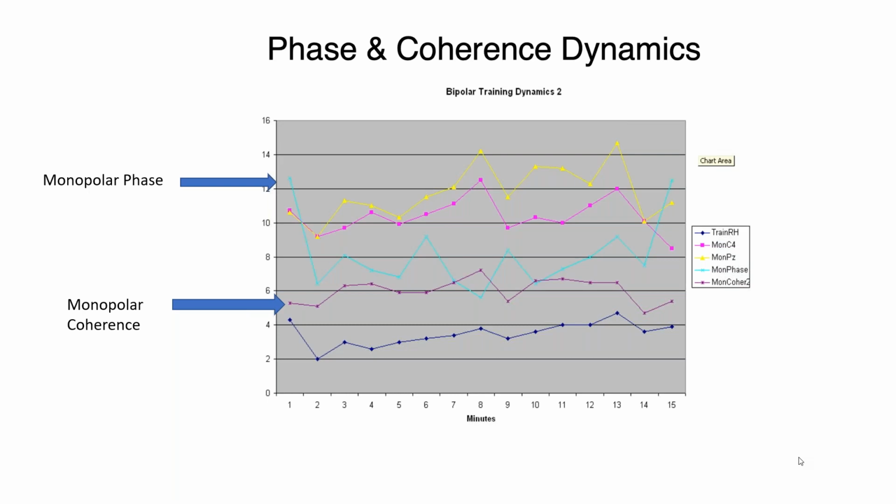I think proportional training is something you could jump into much earlier than multivariate coherence because you're just using slightly different methods to train magnitude, which we're doing, and it's a monopolar thing, and so it's all in the same paradigm, and it's very powerful. But multivariate coherence training, I would wait a while before you jump into that. Thank you. You're welcome. Great question. Great question.